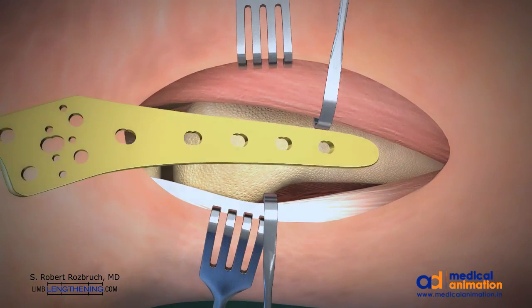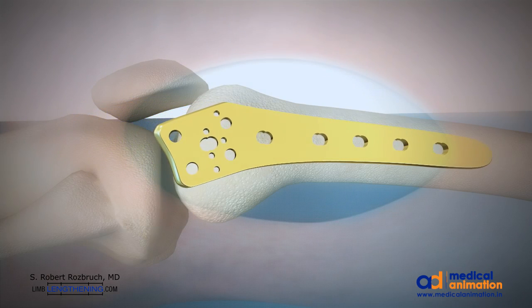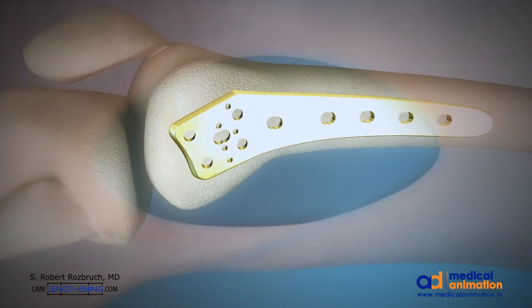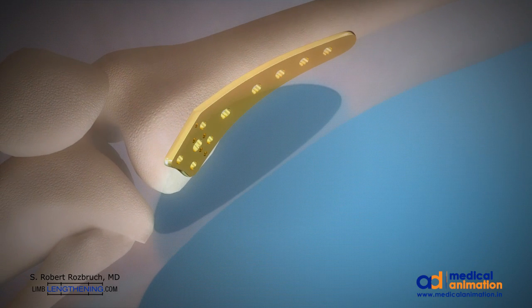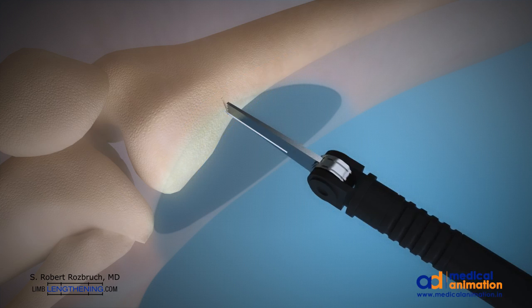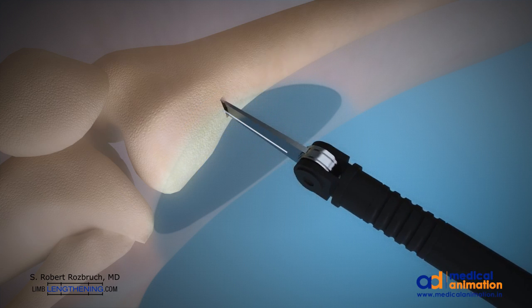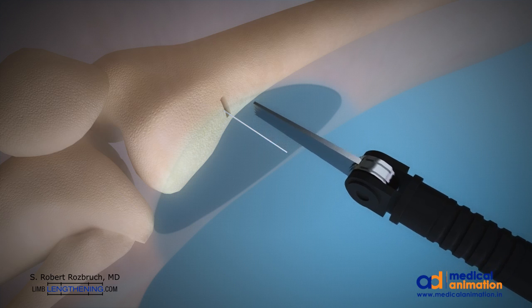I use a titanium plate as a stabilization, and I also use this as a template for choosing my osteotomy location. The position and orientation of the osteotomy is planned with a wire, and then is executed with a microsagittal saw, done while cooled with saline to avoid thermal necrosis.